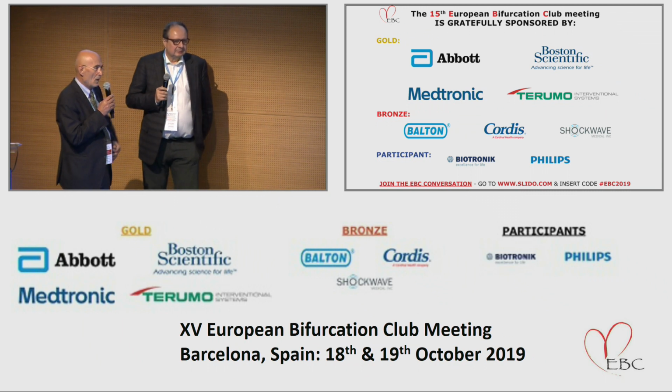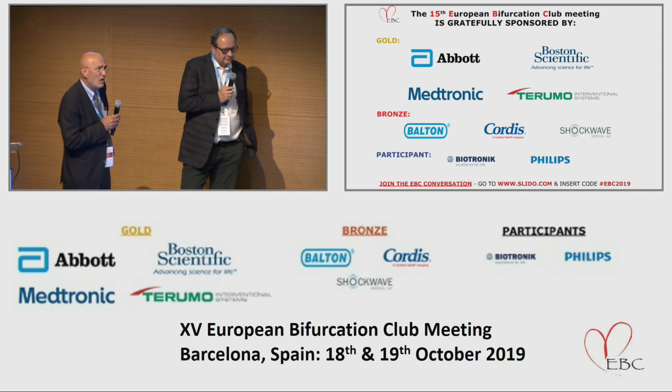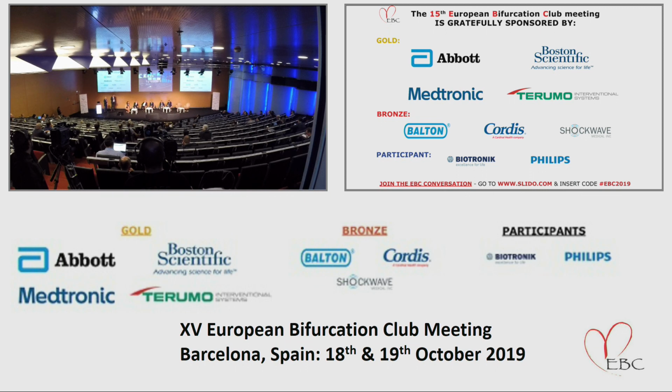Last comment from Remo. Yes, I just want to give you another point of view. Antonio, excellent. Yes, okay. Antonio, so he tried the crush. Then he also tried to do a dedicated stent. Remember? The Culotte was his idea. It's the same concept, to protrude some. If you have ever used the Culotte, the problem is you can't cross with the main stent because the Culotte protrudes in the main vessel and then you catch the stent. So the main problem when you do this side branch first stent is to optimize the stent that protrudes.